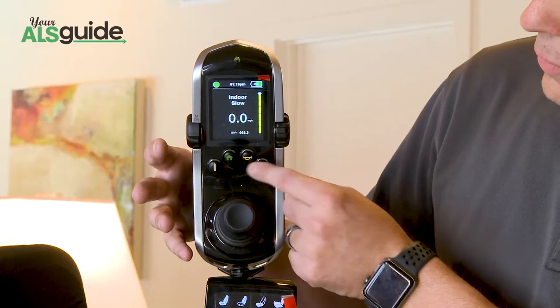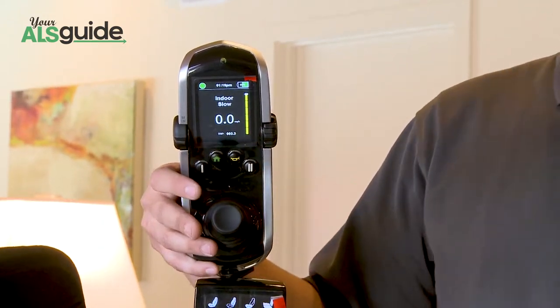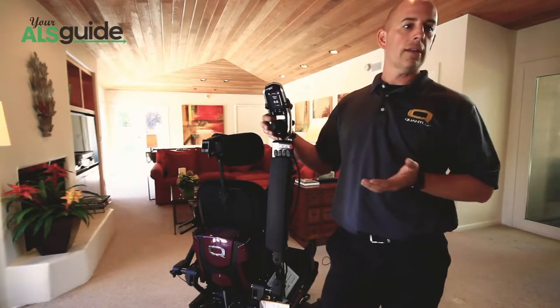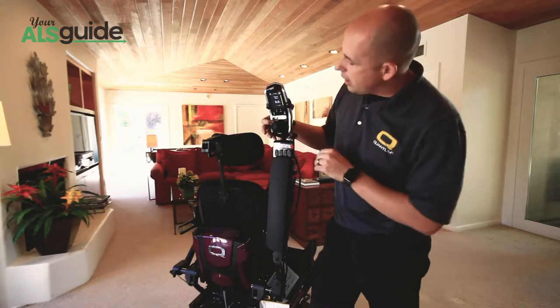Everything on here is customizable. You can make these buttons do tilts, recline, mouse clicks. I don't want to overwhelm with too much info, but just know that there's a lot that can be customized and tailored to you, and you'll work with your ATP on that.